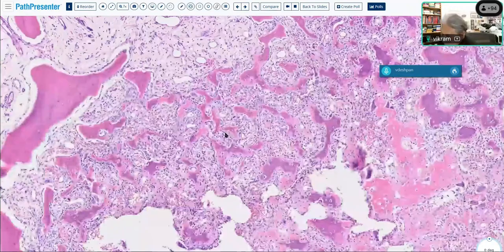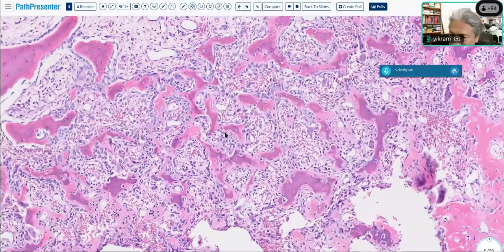There are not that many bone forming tumors, but they're classic bone forming tumors, and then there are other tumors that can produce a little bit of bone. So, for example, if you think of a giant cell tumor, you're not thinking of a bone-forming tumor, but I can guarantee you that you'll see a little bit of bone in a giant cell tumor. And if you treat that patient with denosumab, we wrote this paper many years ago, you'll have an explosion of bone formation. So giant cell tumors can produce bone.